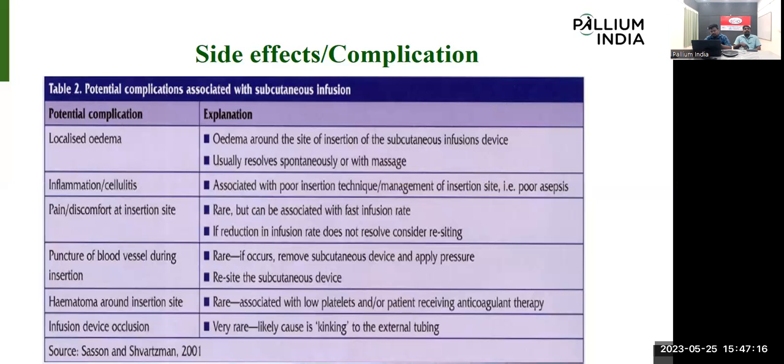While they keep the needle in the space, during walking or during their work, they may get an accidental hit on that space, maybe on the door side or the corner of a wall. If that hit happens, the needle may accidentally puncture a small capillary, and there is a chance of seeing blood or blood-tinged fluid inside the tubing of the SV set.